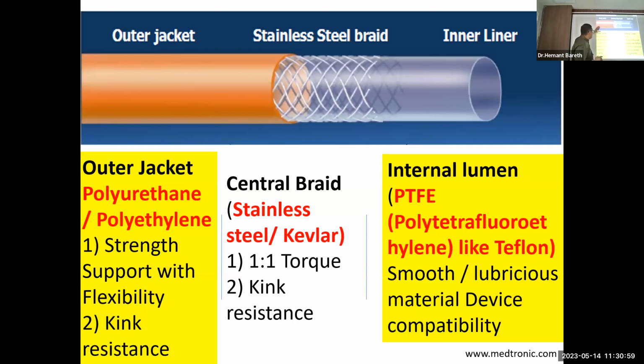And also it comes in contact with the coronaries, and therefore it has to be biocompatible. If it is not biocompatible, then there will be formation of thrombus if you remove this catheter. So it has to be biocompatible.